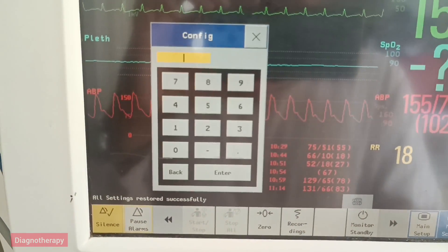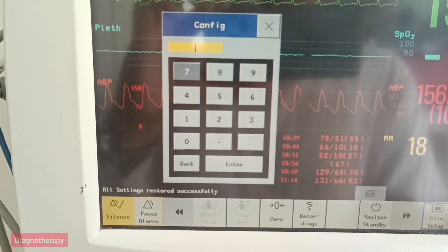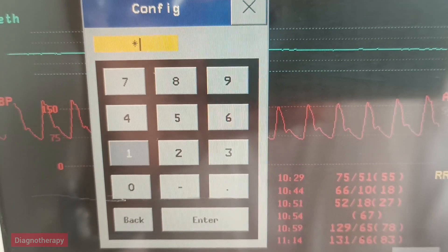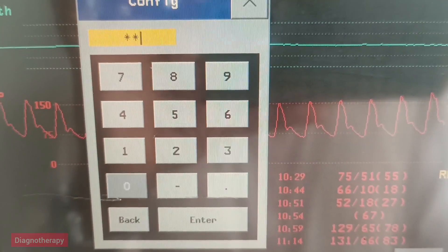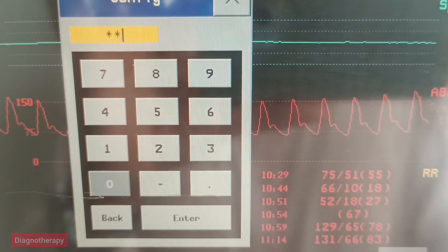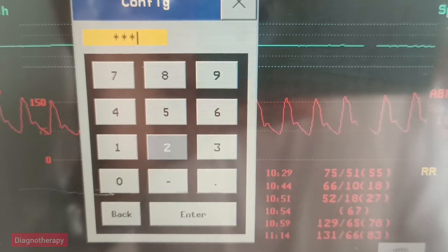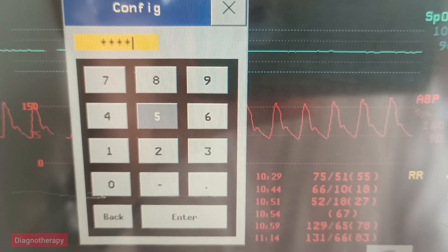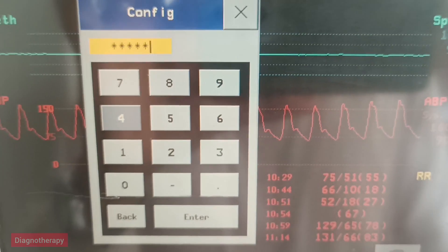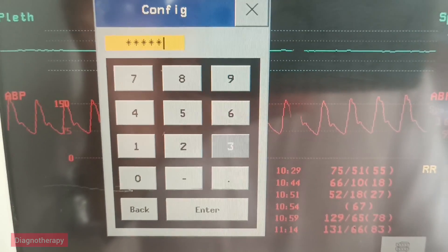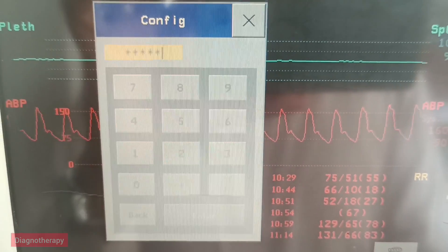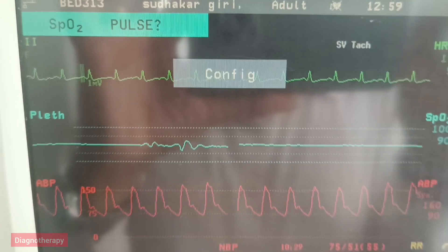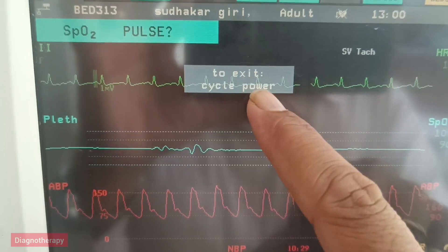In configure, press the scroller and then press for the password. Type in the password. After you have successfully entered the password, scroll down to enter. The monitor will show it is in configure mode.